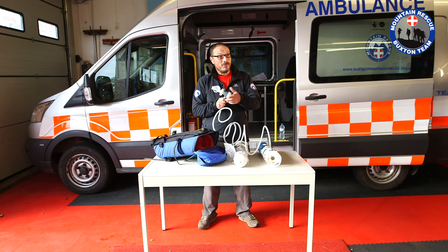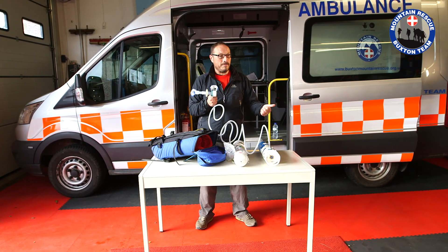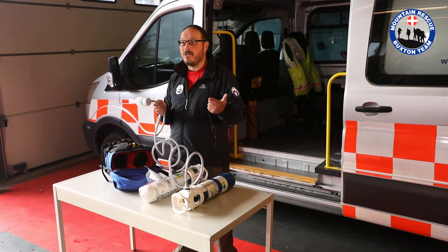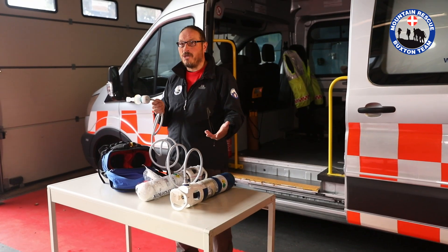So who might get Entonox? Pretty much anybody who's in pain. It's absolutely fantastic — it's very quickly administered, very quickly absorbed by the casualty, so it's very quickly acting. If for some reason we want to stop using it, it's very quick to take away. And all we actually have is a handful of contraindications to this.